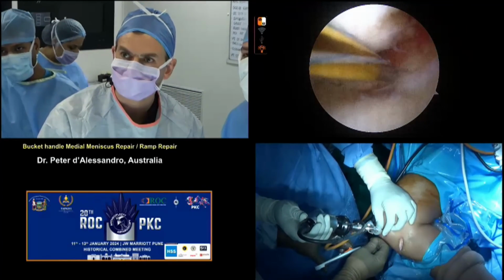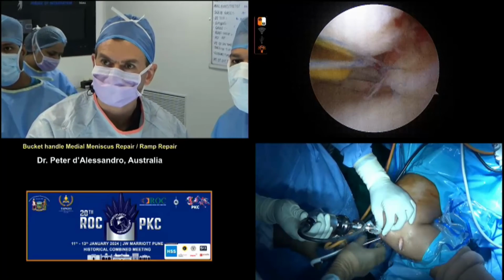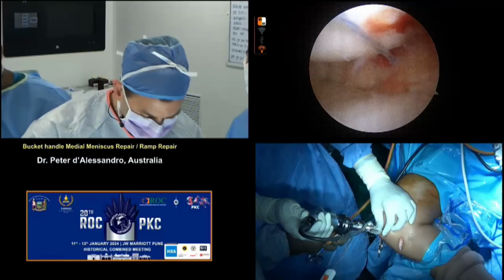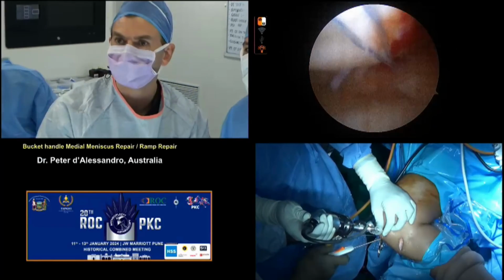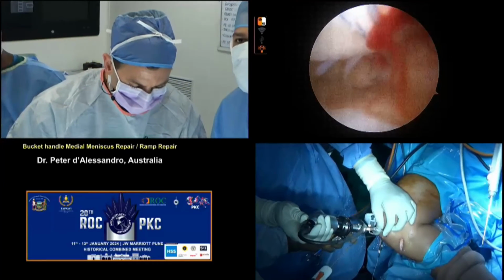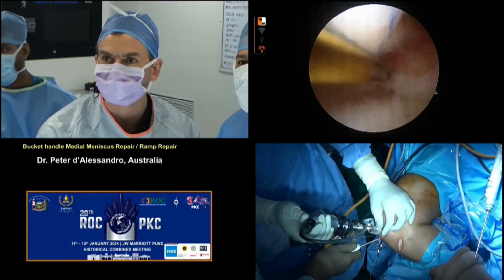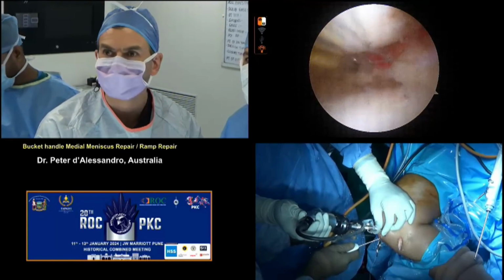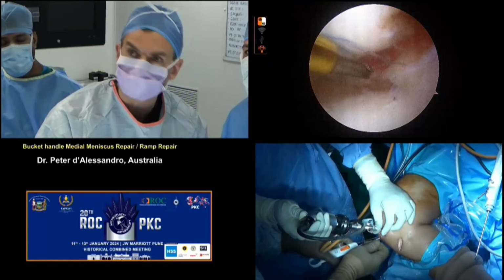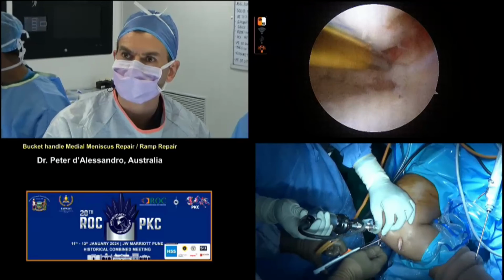So it's more of a T-shaped tear. So you're going to address the horizontal component as well, or is just a radial side to side sufficient for you? Which horizontal component are you referring to? On the root side here? The root side, yeah. Okay, we'll have another look at that. But certainly the fixation and the reduction I feel like we have here at the moment, I feel like we're doing okay.